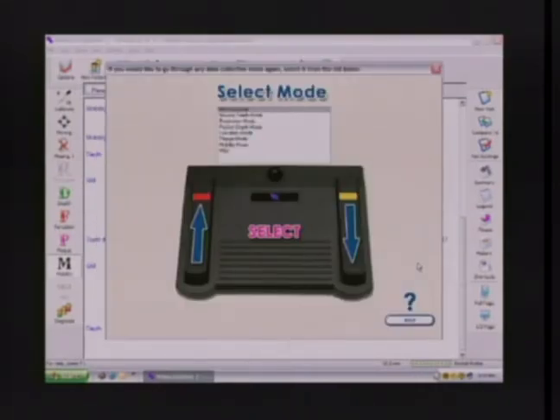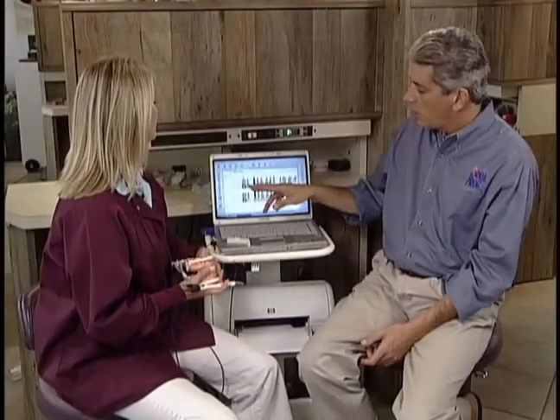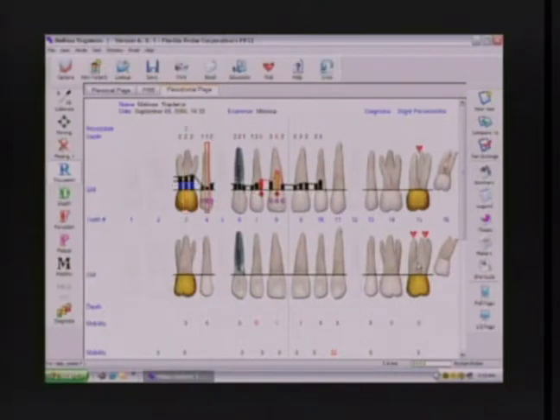Use your side pedal to highlight recession. Upper arch, recession. Excellent. On our patient, our first significant recession is where? Number 3. Okay, so let's measure 3. We insert the tip, contact the margin, step once, CEJ, step again. 3. Okay, and it advanced to 4. Recession on 4, measure it. 2. Excellent. Let's advance over to 11.